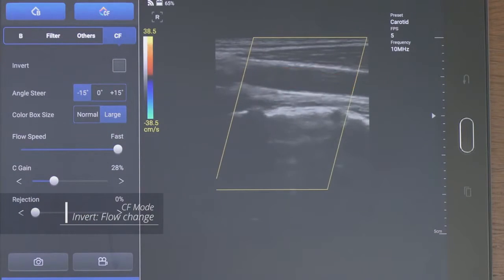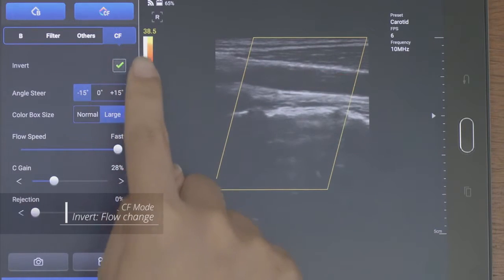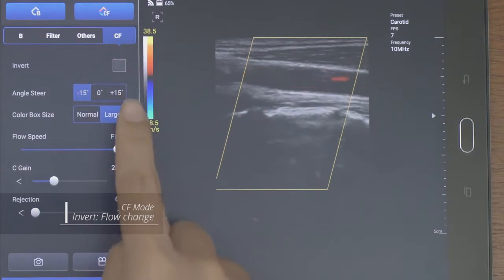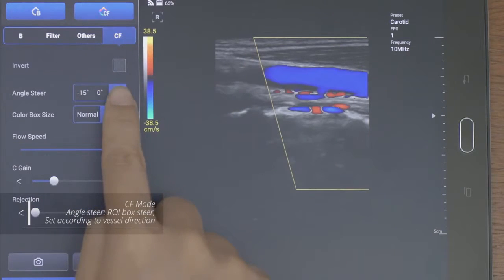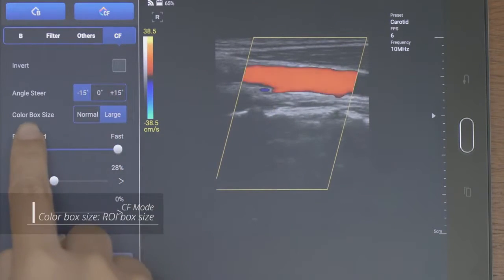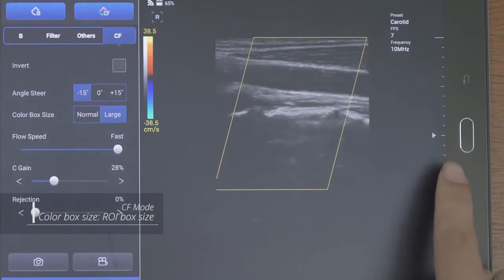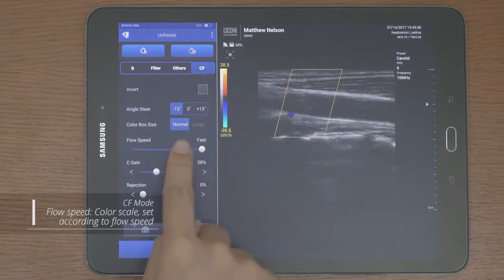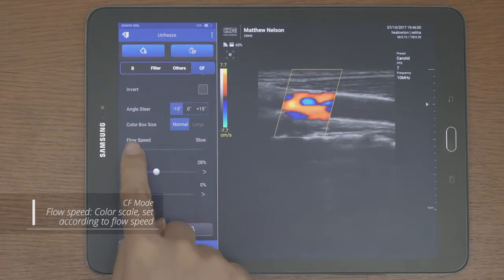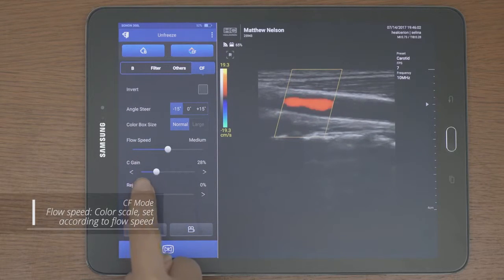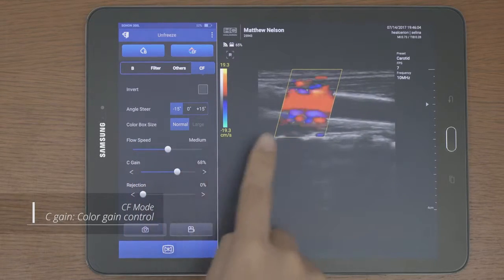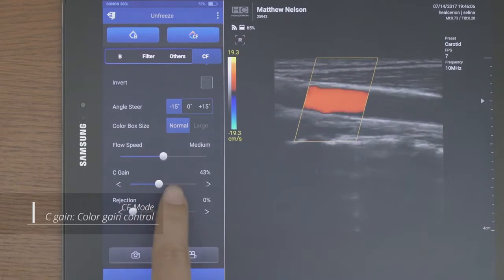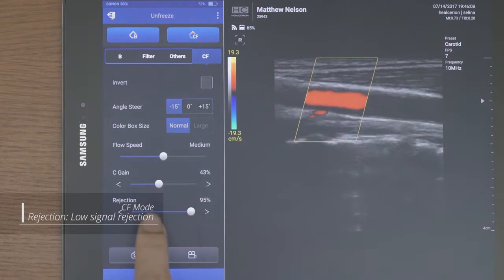In CF mode, you can adjust the invert, angle steer, color box size, and PRF scale in flow speed. C gain and rejection can be adjusted too.